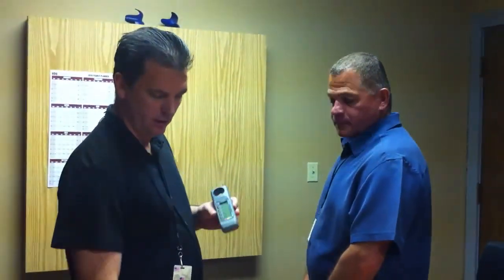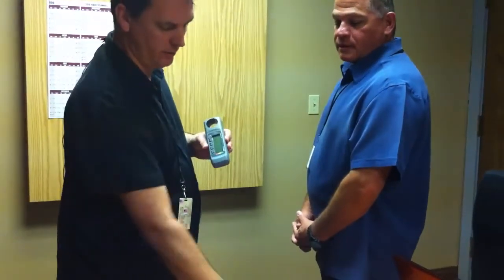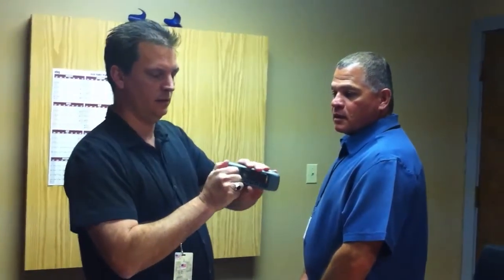After we've got the data into the SpiroBank, we're going to perform the spirometry test. So we're going to grab a brand new turbine, open it from the package, and insert it here, and twist it clockwise so it locks.